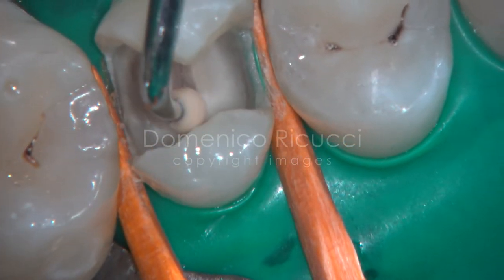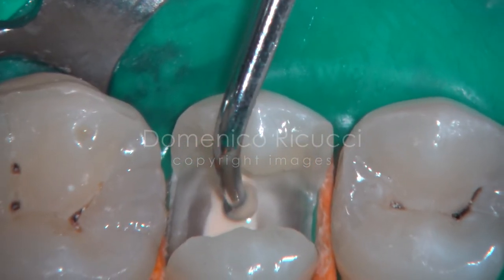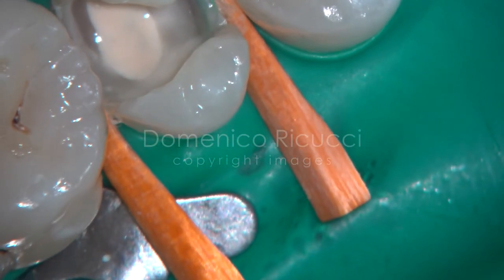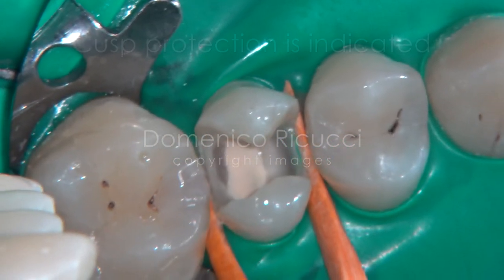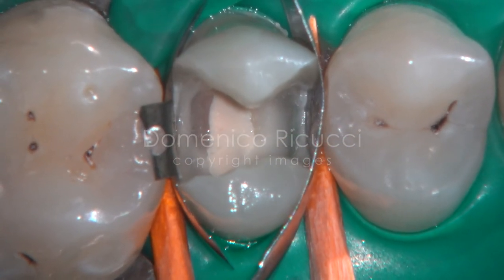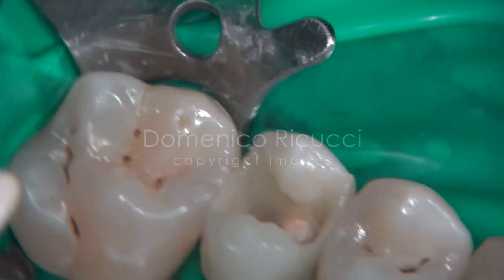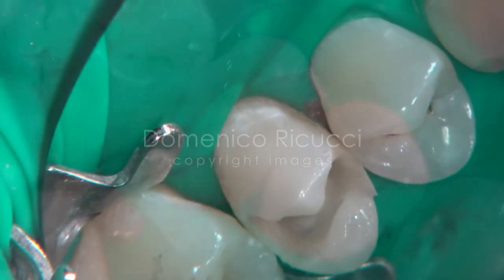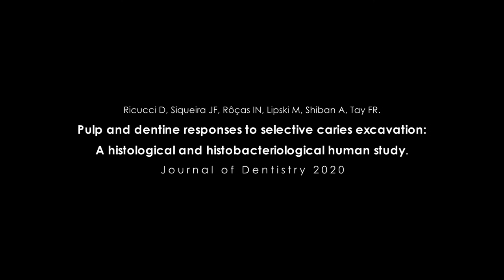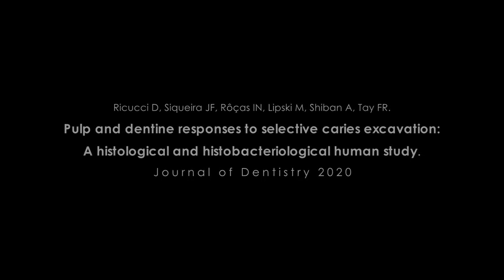The deepest part of the cavity is covered with a calcium hydroxide base, and build-up of the crown is accomplished with composite materials. Given the severe loss of dentin and the weakness of residual cusps, this tooth will require cusp protection through an indirect restoration.